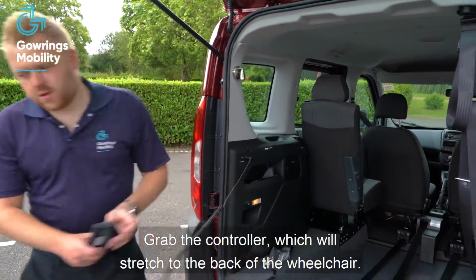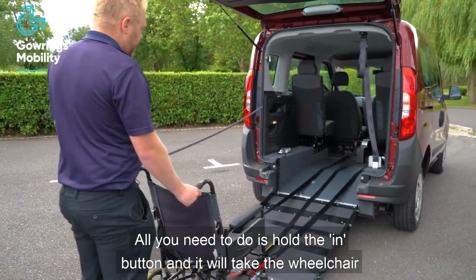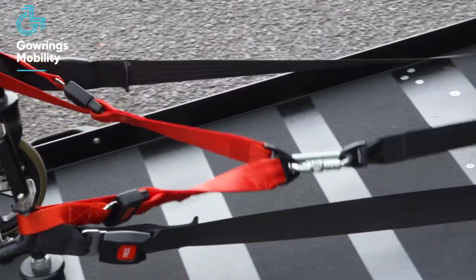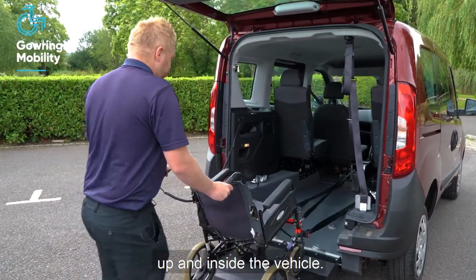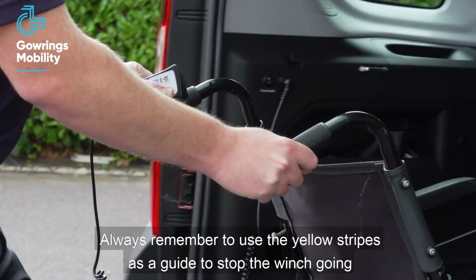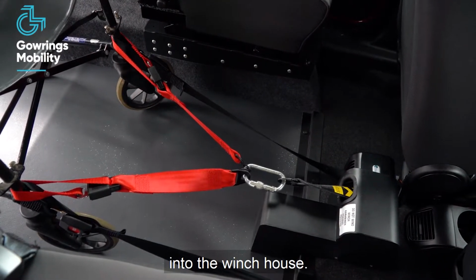Grab the controller, which will stretch to the back of the wheelchair, and all you need to do is hold the in button and it will take the wheelchair up and inside the vehicle. And always remember to use the yellow stripes as a guide to stop the winch going into the winch house.